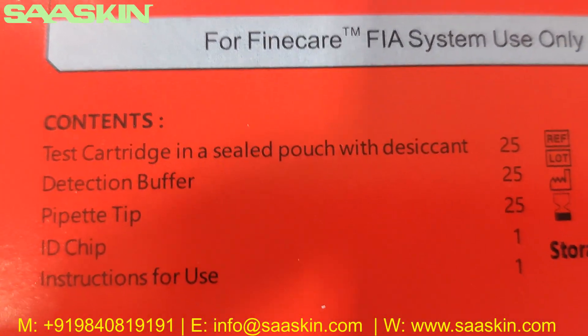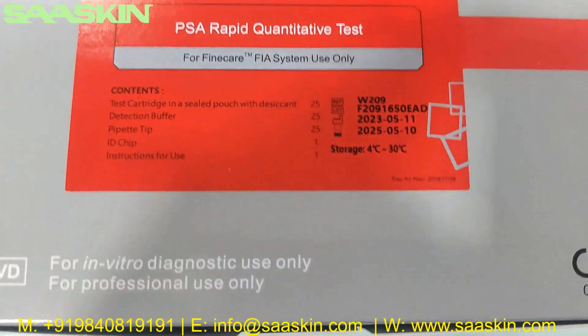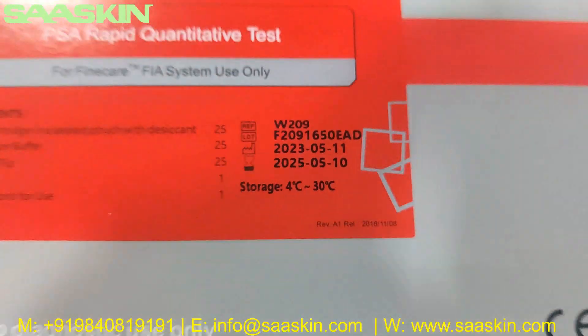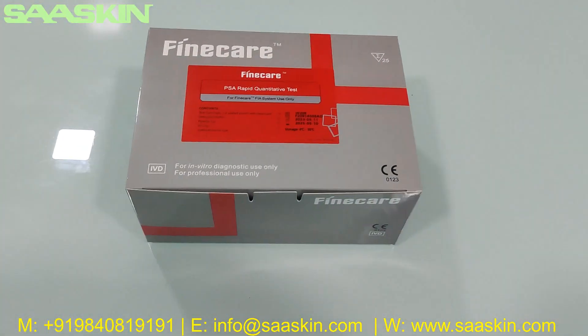You can see the key contents here are the test cartridges, dilution buffer, paper tips, ID chip, and the IFU brochure. On the label you can see there is a 2-year expiry period, and you have the reference part number and also the lot number. This is a 20-test kit pack.